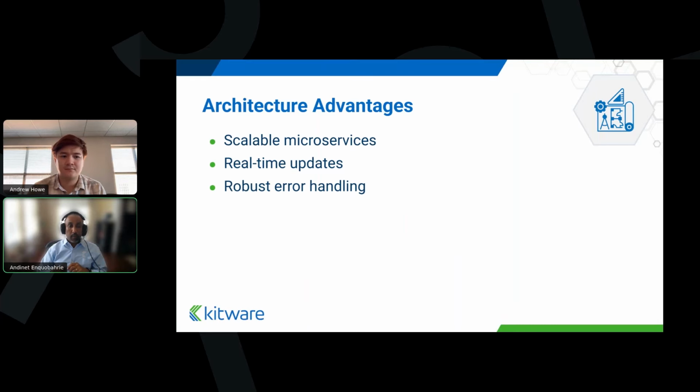All right. When you are running the chat server, if you run into some issues, the whole system is not going to come down. The other parts of the application are going to continue to function. For example, if your chat server is failing, your segment and generate servers will still be functioning. So it has a good way of handling those types of issues. So it has some resilience designed into the system.